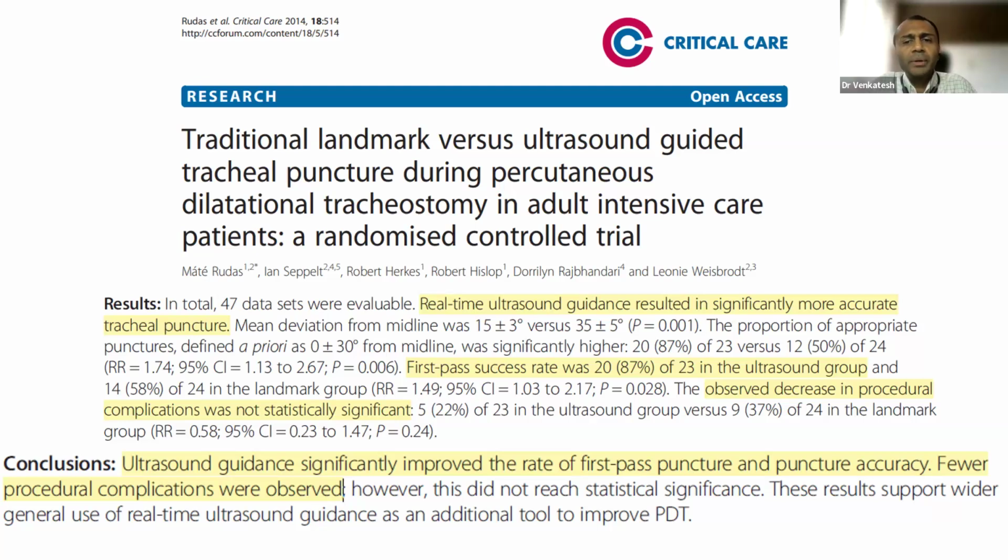The success rate was quite good, 87% in the ultrasound group, whereas it was 58% in the landmark group, which was also significant. The observed decrease in the procedural complication was not statistically significant, but it significantly improved the first pass puncture. And the complications were very few, which was not statistically significant.